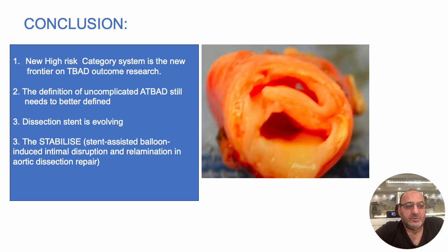Stabilized technique, we use it most of the time. There's really not much data out there to support it yet. The best data that I could find is the meta-analysis that I showed you earlier. But in our institution, we've done this a lot, and we've had a really, really good outcome with it, and good remodeling.